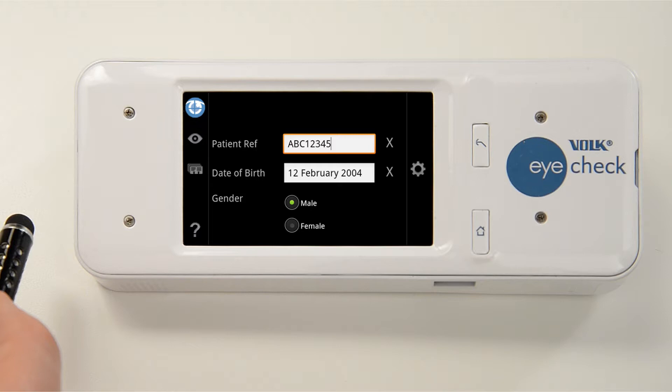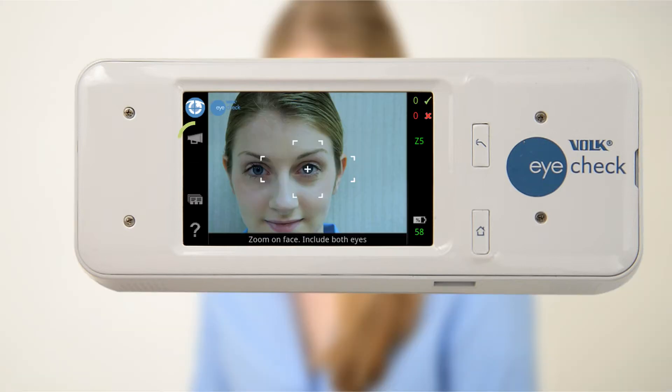The optical lens will extend and automatically be set to the correct zoom setting. The megaphone icon on the left hand side will only appear when the sound feature has been switched on. If you'd like to use the sound feature, press this icon to initialize sound.